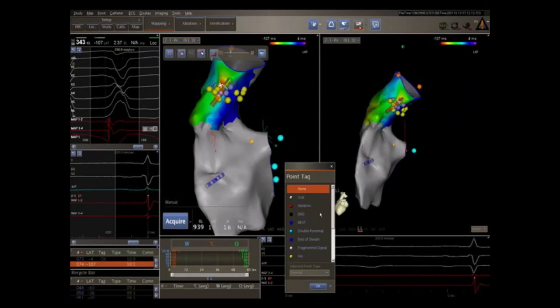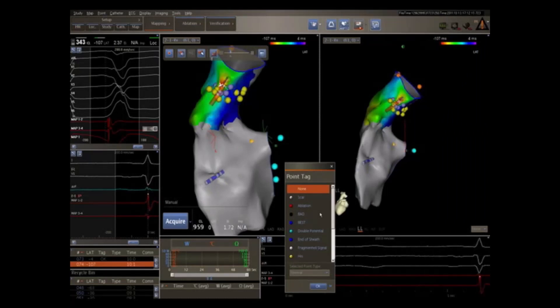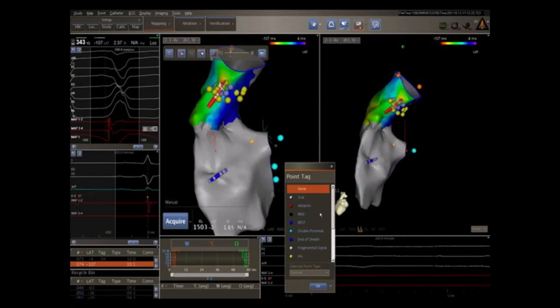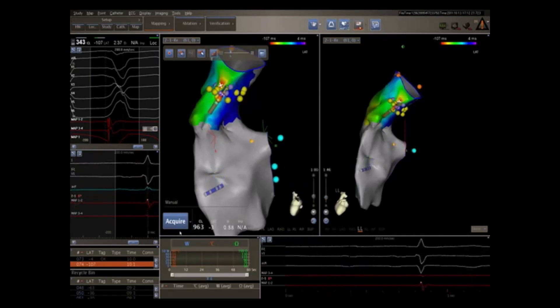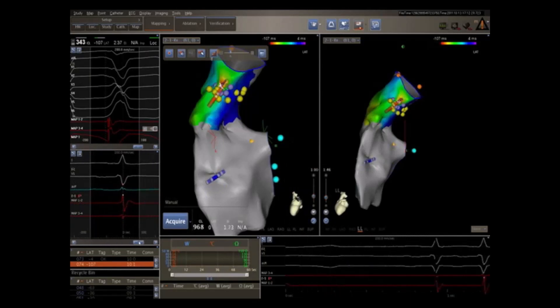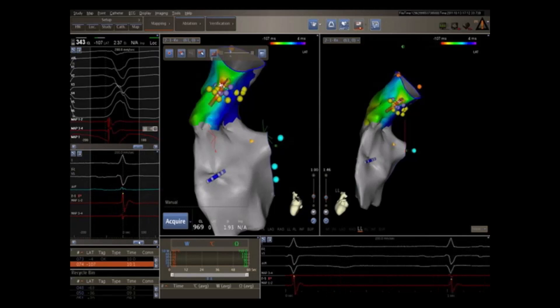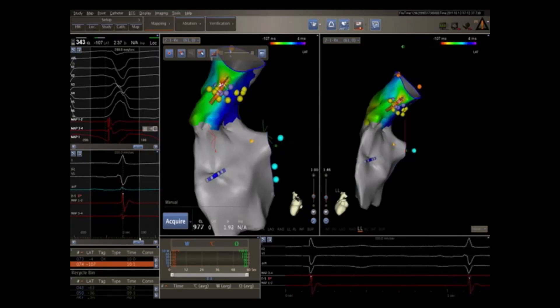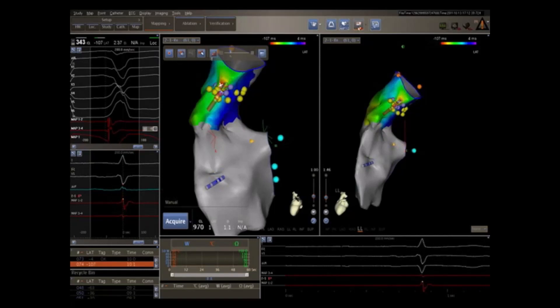If enough PVCs are seen or ventricular tachycardia is present, activation mapping using the three-dimensional mapping system is used. Points are taken and activation relative to a reference electrogram — either the right ventricular catheter or the 12-lead ECG — is color-coded on the map. Early signals are coded red and late signals are coded blue-purple. You should see an early red area with centrifugal spread of colors outward.